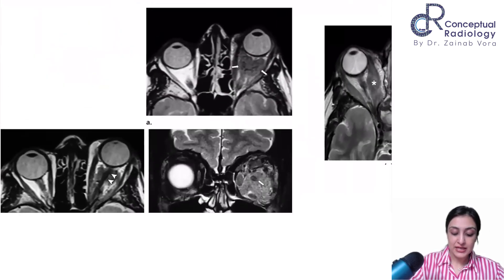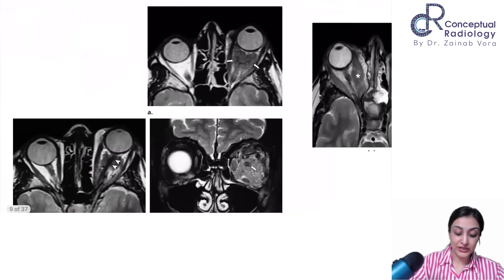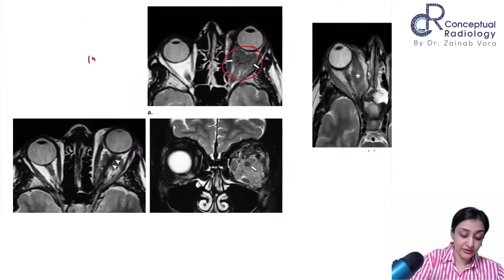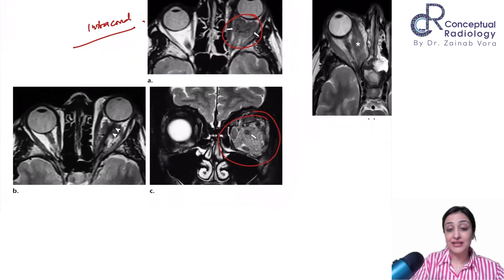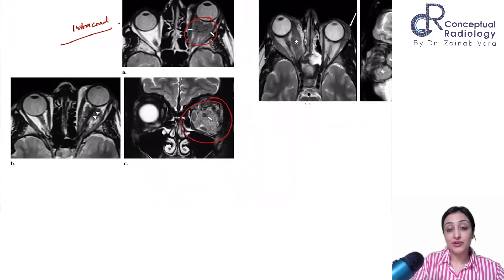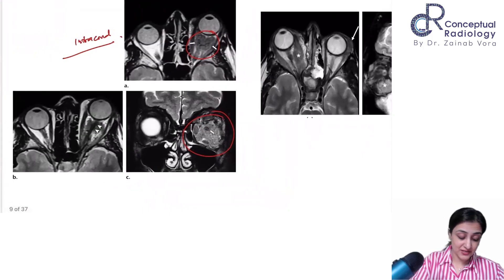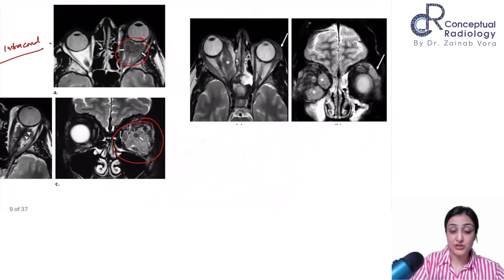Another case: T2 hypointense infiltrative intraconal pseudotumor encasing the optic nerve — hypointense on all sequences. This is a very infiltrative mass lesion. This is how pseudotumor can present, with resultant axial proptosis in this patient.